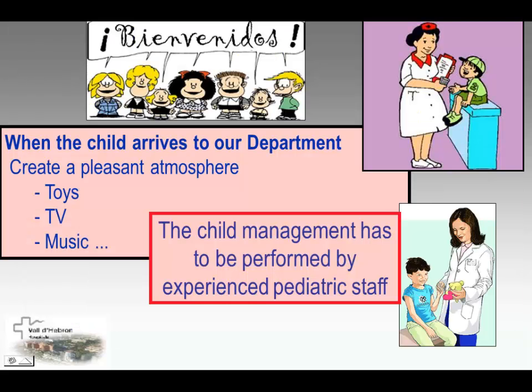And when the child arrives to our department, she has to find a pleasant atmosphere with toys, television, music, and a good predisposition of all the team. The child management has to be performed by experienced pediatric staff. This is a very, very important point.